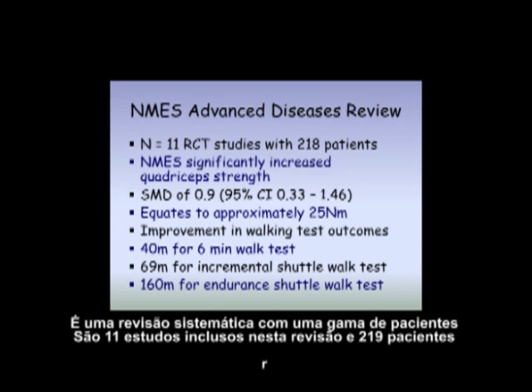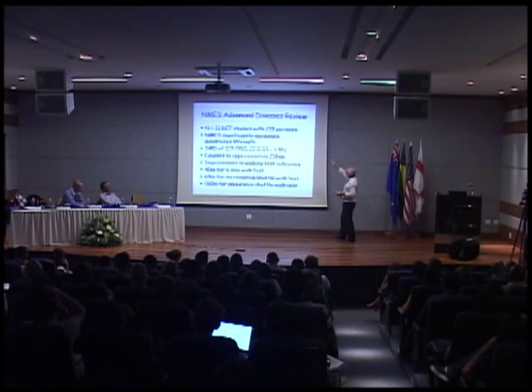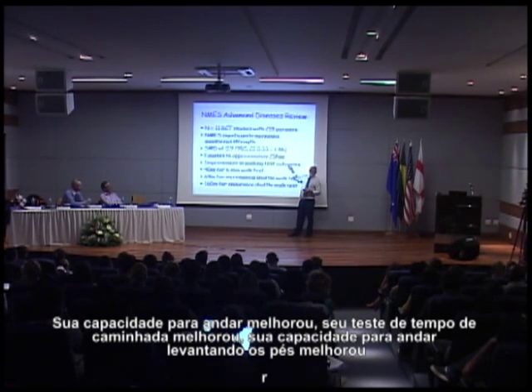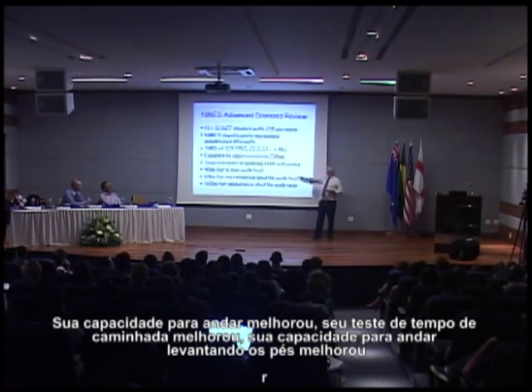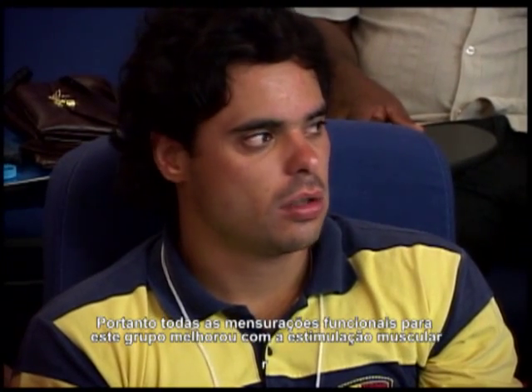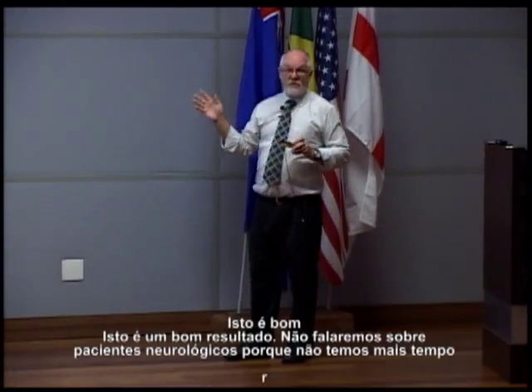There are 11 studies included in this review and 218 patients. And what they showed was that their quadriceps strength was significantly improved with muscle stim. Their walking was improved. Their walk test time was improved. Their shuttle walking was improved. So therefore, all the functional measures for this group improved with muscle stim, which is good.